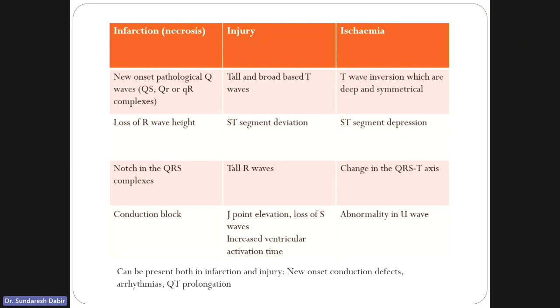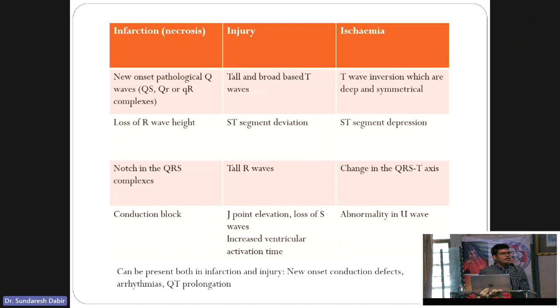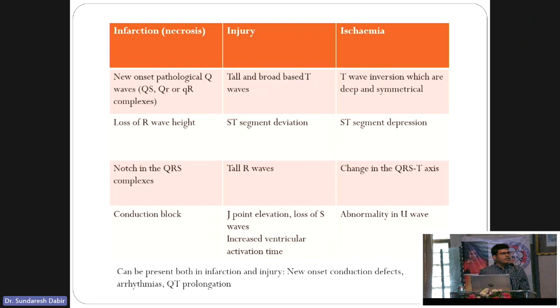I will first talk about ST elevation MI. In ST elevation MI, you see ST segment elevation over the area of damage and there should be reciprocal ST depression — these go hand-in-hand. You also have to look for T inversions and pathological Q waves.